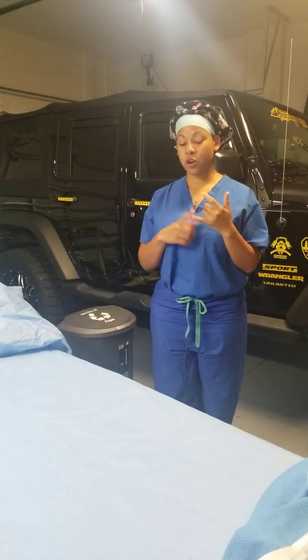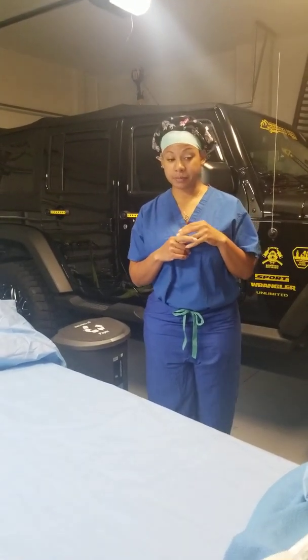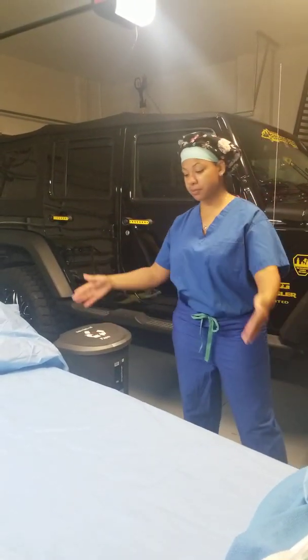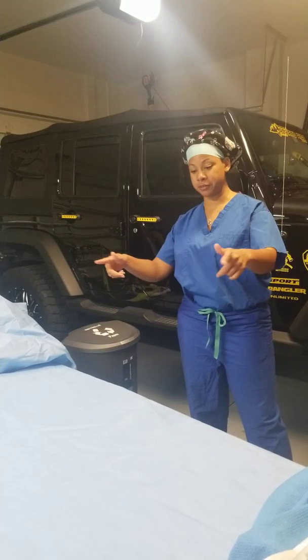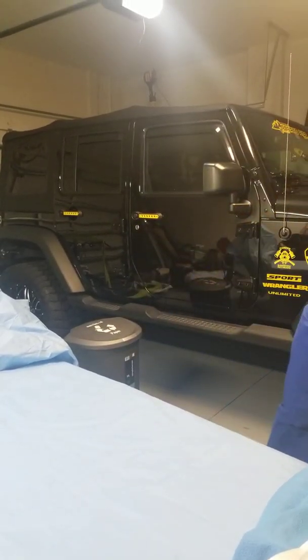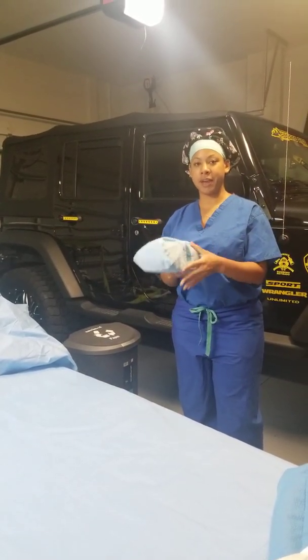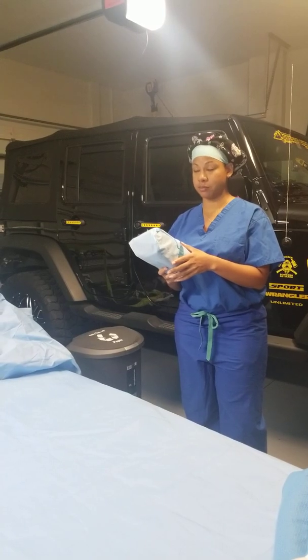We're going to open envelope-wrapped items and peel-packed items. This is representing my sterile field, and this is going to be my ring stand. I'm going to start with an eight-pack of towels that have been envelope-wrapped.